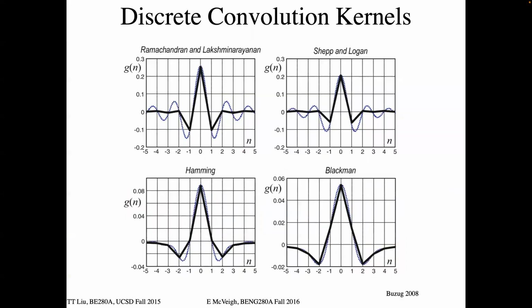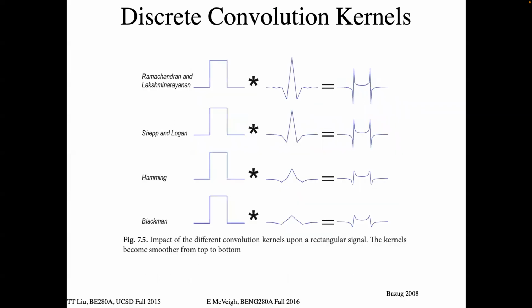So here's some of the discrete convolution kernels that get used. You know, there's 10 points in these ones. So you take your raw data that's just coming straight from your scanner detector, and do a discrete convolution with this before you back project. Okay? And it's very fast. So CT reconstruction for a long time has been very fast because it's this simple process of just convolve and back project, and you can build an array processor to do that easily. And they built special ones.